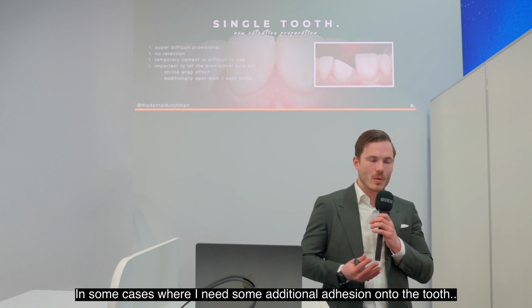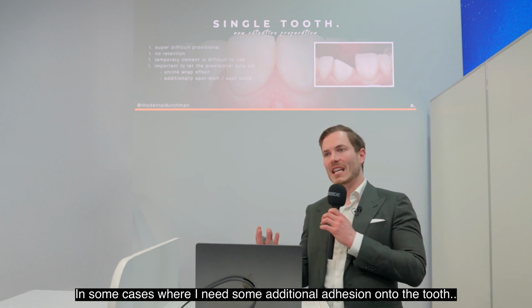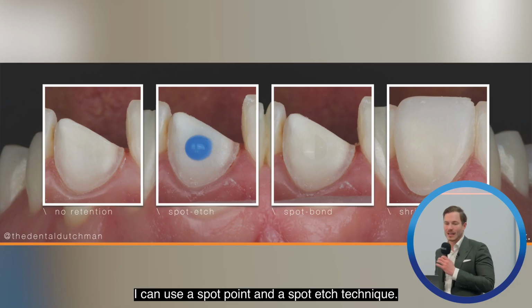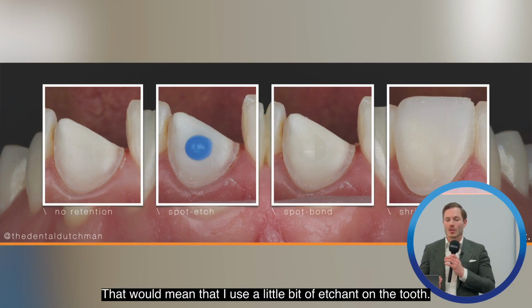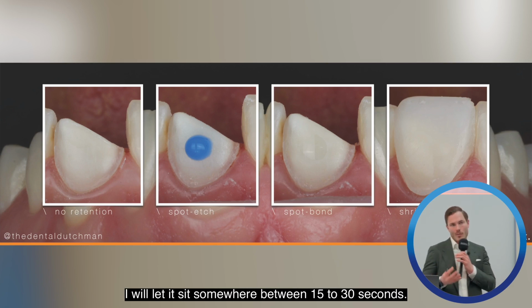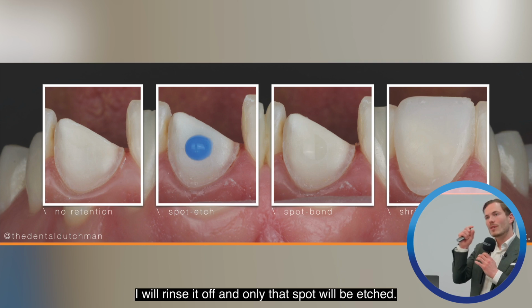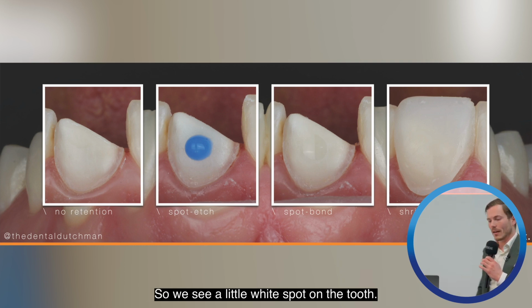In some cases where I need some additional adhesion onto the tooth, I can use a spot etch technique. That would mean that I use a little bit of etchant on the tooth. I will let it sit somewhere between 15 to 30 seconds. I will rinse it off and only that spot will be etched. So we see a little white spot on the tooth.